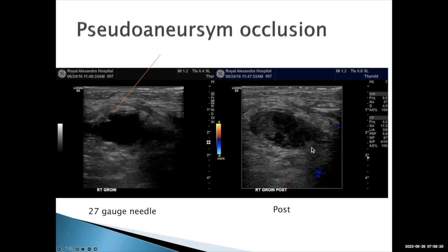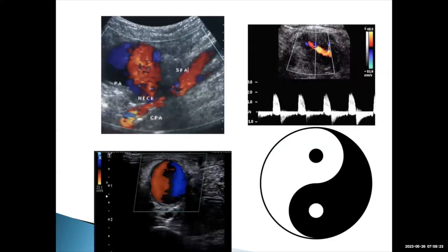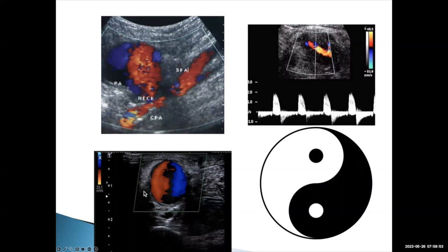It's a very high-yield, very satisfying procedure — we basically cure the patient and send them on their way. Here's another example with a superficial femoral artery showing a narrow neck with the yin-yang sign. Putting the spectral Doppler waveform over the neck shows flow toward and away from the transducer — that is the to-and-fro bidirectional flow characteristic of pseudoaneurysms.